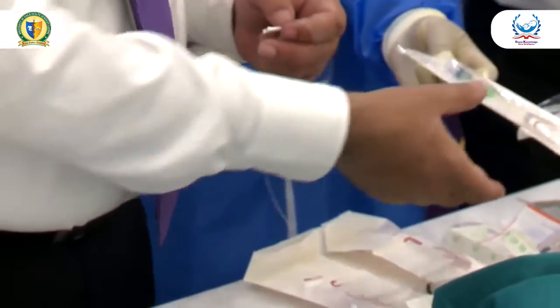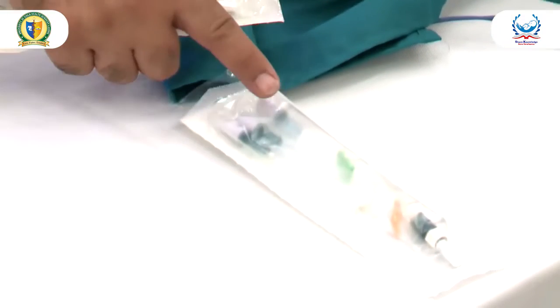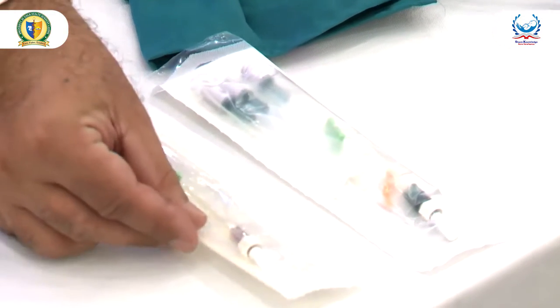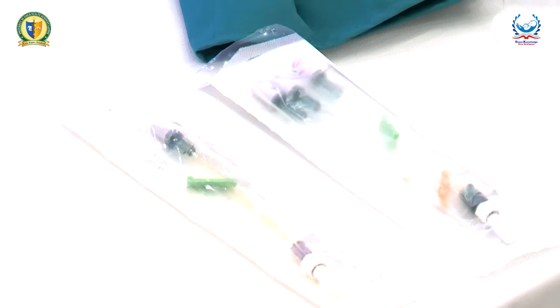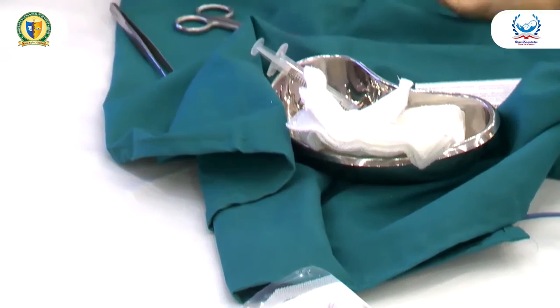So this is a three-way, I won't open it. This is a three-line octopus. This is a single line with needle-less connectors. You can get it without needle-less connectors also. So all these are used for infection prevention. Germs cannot enter this port. But if it is like this, yes, they can enter.